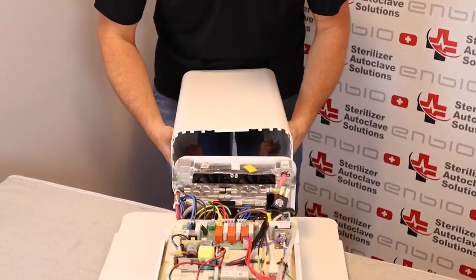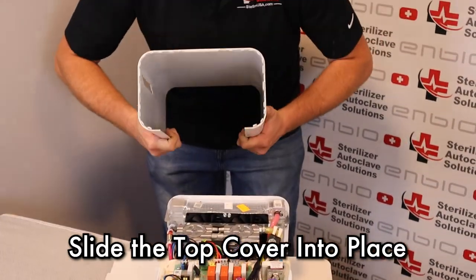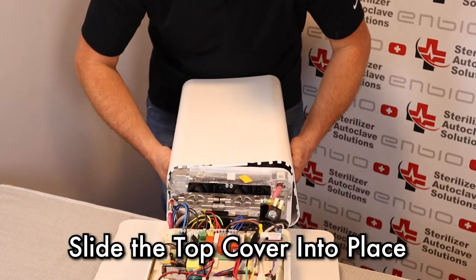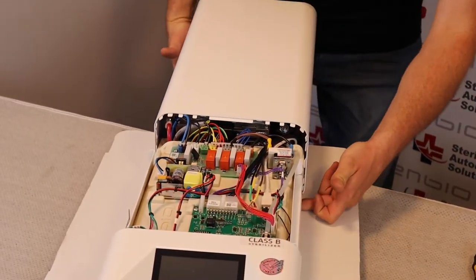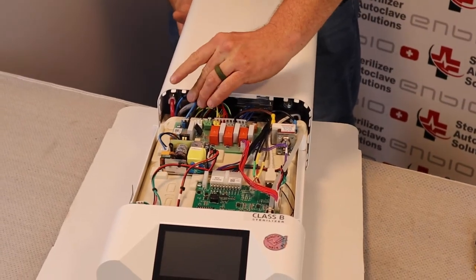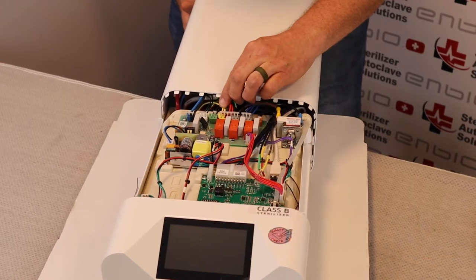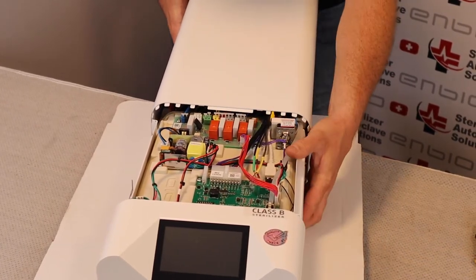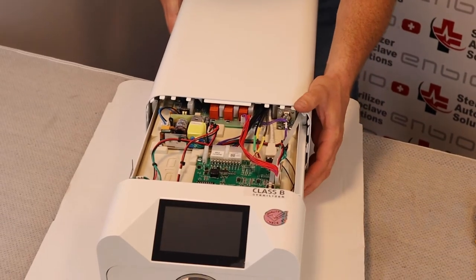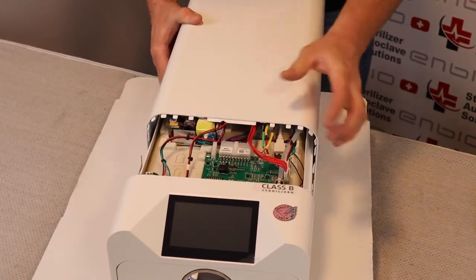Standing behind the unit, you want to spread the top cover apart and gently walk it on. You want to ensure that the bottoms are completely around the bottom base plate. Slowly pushing this on, you want to make sure that no wires are getting caught.